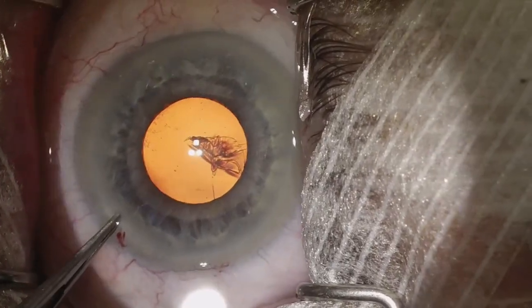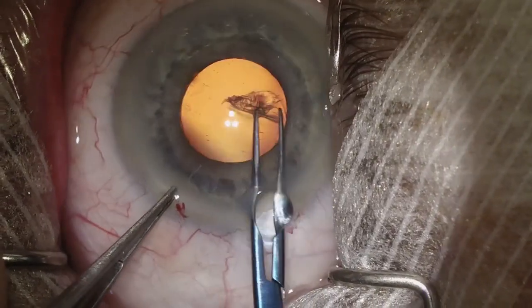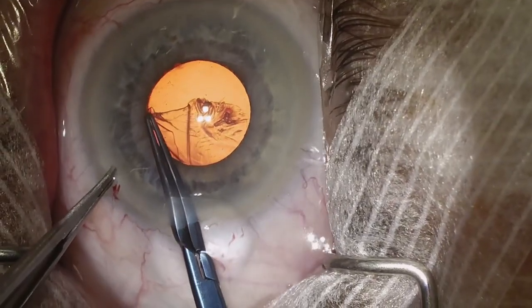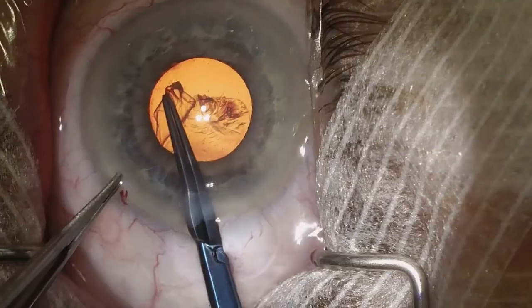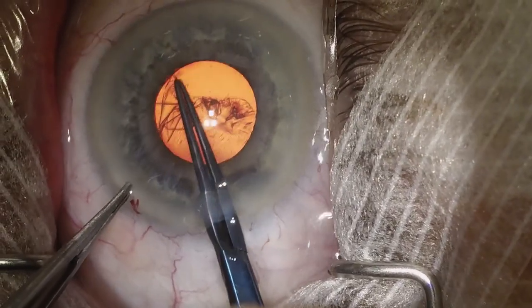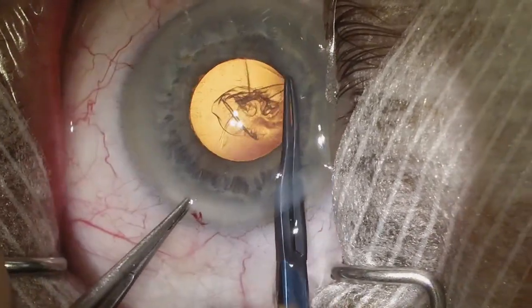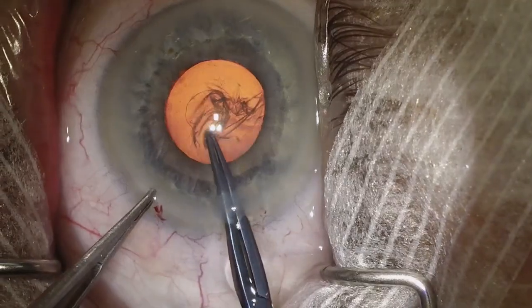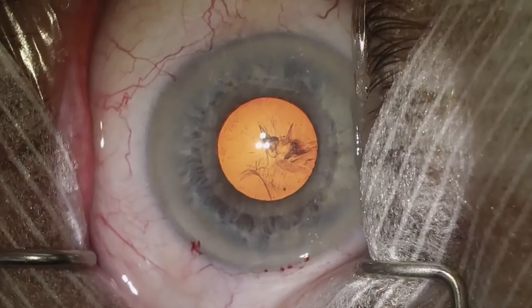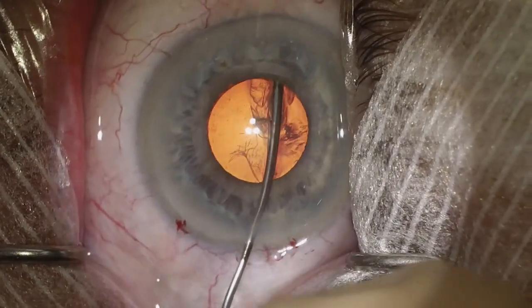We start the capsulorhexis with a cystotome. We make a continuous curvilinear motion and we've already raised the flap without having to make multiple passes. We use our Utrata forceps or capsulorhexis forceps to continue the capsulorhexis. You can see here we're not afraid to go underneath the iris margin — it's highly unlikely for these capsulorhexis to run off. Something about the way the iris is or the way it changes the forces makes it unlikely for these to run off.